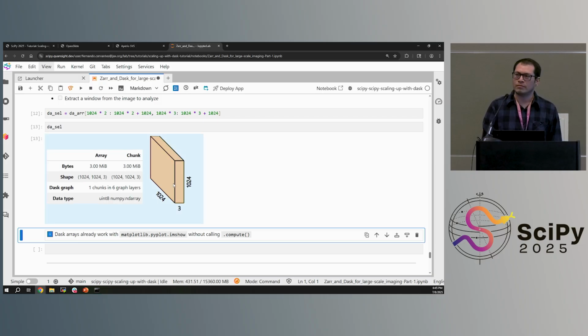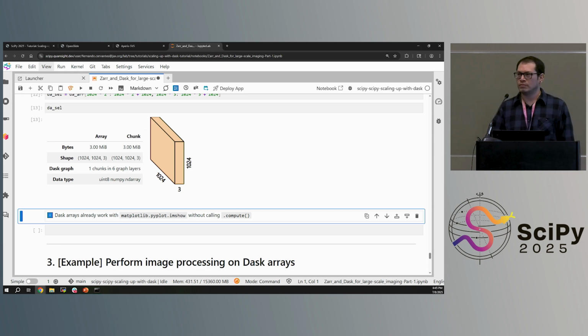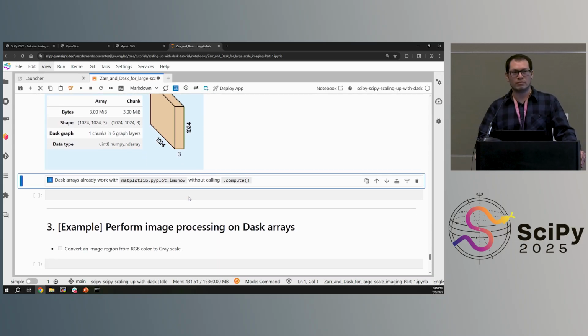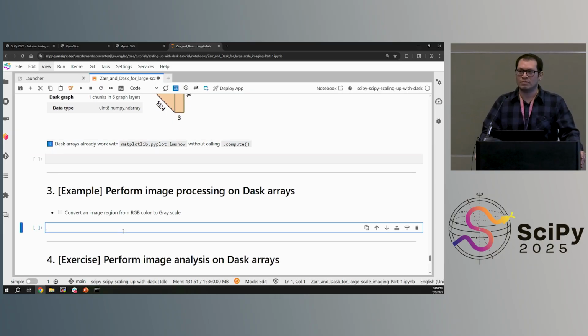There's a whole host of formats that are really just TIFFs that are tweaked a little bit. So SVS, there's NDPI, there's a host of these different file types that are really just TIFFs. So tifffile is a very powerful Python library for doing this. I would say it's the cream of the crop. If you're doing anything with these types of files, find a way to use tifffile because it's the most performant. And it has this cool Zarr backend, which is very, very useful.